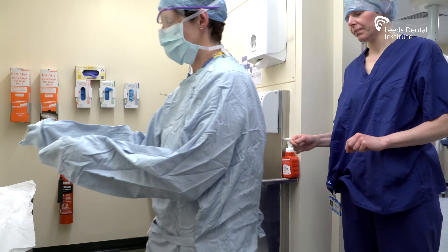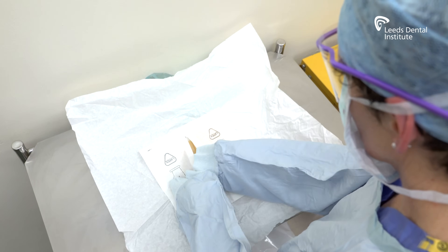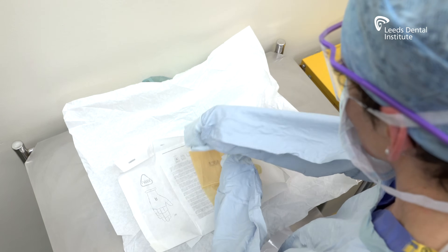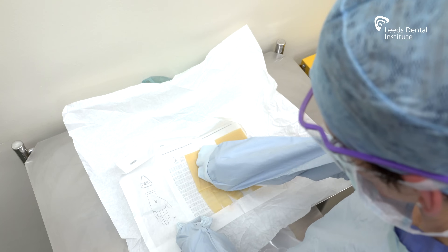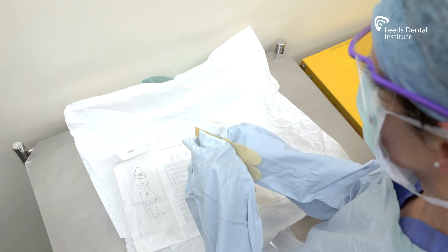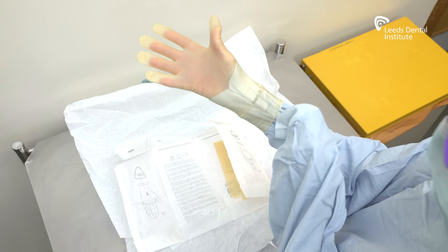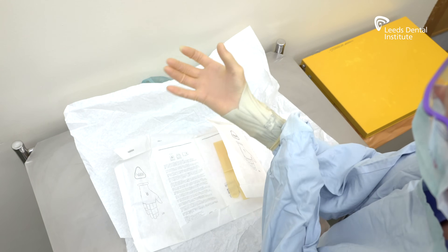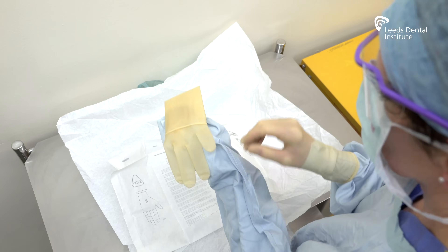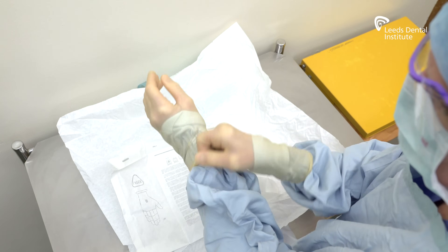You are then ready to place your gloves. Keep your hands within the sleeves of the sterile gown and draw the sterile glove pack towards you and turn it around. Open the pack so that the gloves are facing fingertips towards you. With one sleeve-covered hand, grasp the thumb and forefinger of the corresponding glove by the folded cuff edge, ensuring your thumb is aligned with the thumb of the glove. Using the other sleeve-covered hand to grasp the uppermost edge of the glove's cuff, stretch this over the back of your hand and straighten your fingers into the glove. Grasp both the glove cuff and the sleeve to pull the glove onto your hand. Repeat this for the other hand. Make sure the gown cuffs are covered.